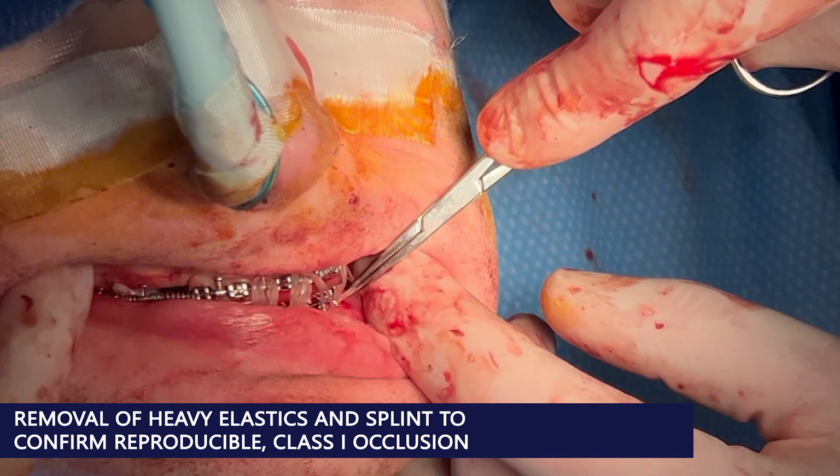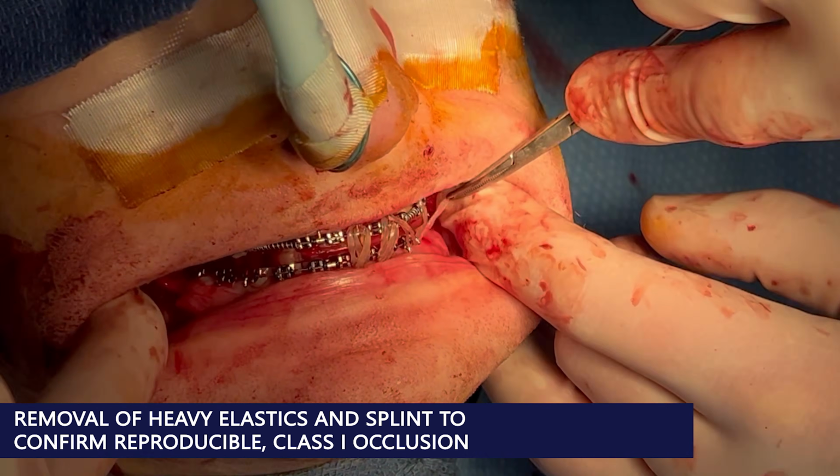I verify that both condyles are seated properly and also that the teeth are in the splint correctly.